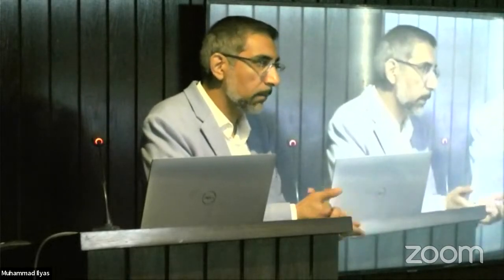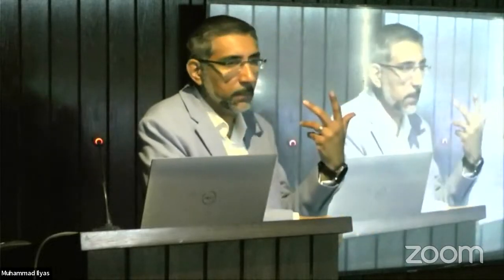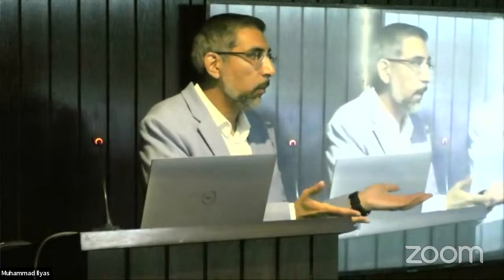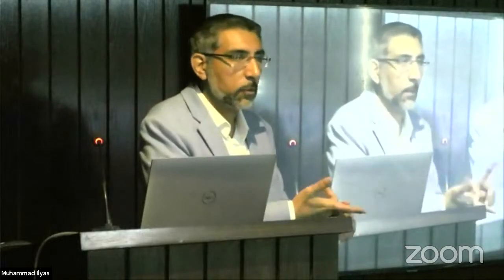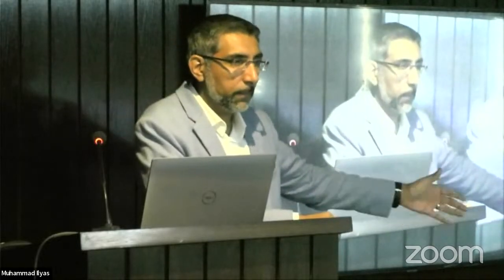And then, it takes me what, 20 minutes to do an angiogram? Less than that, right? If you're quick, in 20 minutes you quickly select your vessels, do the angiogram, and you answer the question. You're like, no AVM, no aneurysm, no fistula. Then you start looking for other causes, because if the poor guy actually has a fistula.